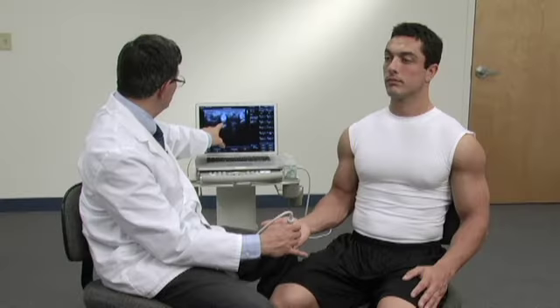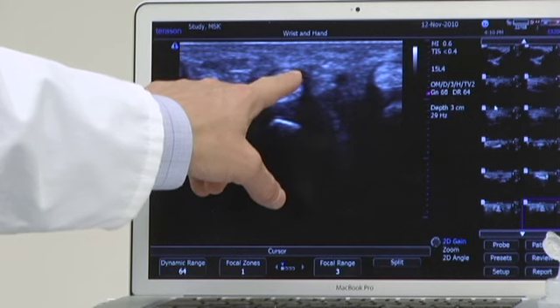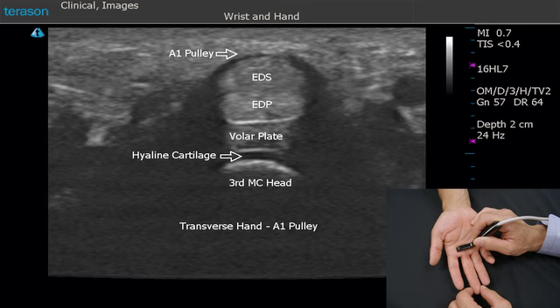As we move distally, you'll begin to see a dark area over the top of the tendon and a little bright area just above it. That represents the A1 pulley.